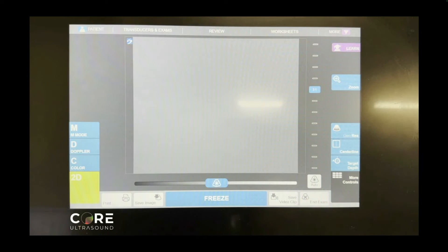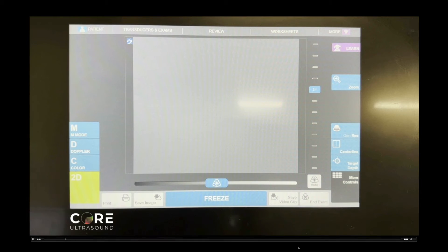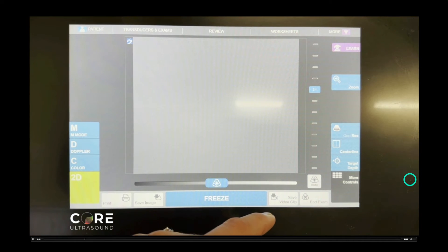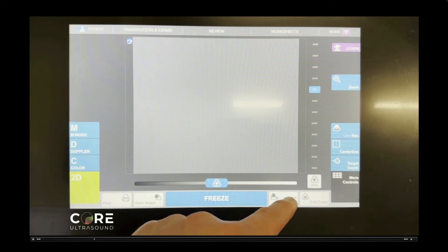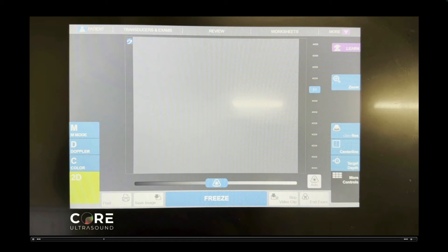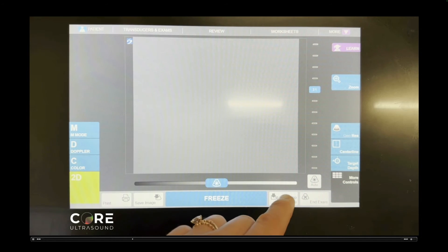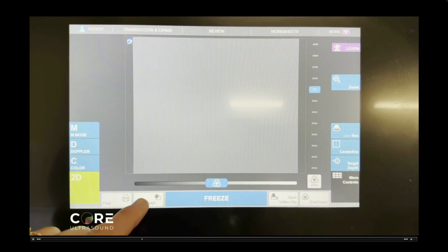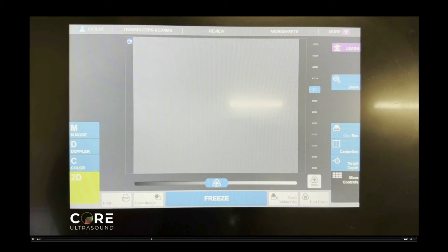Now to record images, you'll go ahead and hit that save video clip right here, or you'll hit the save image if you wanted to take some kind of a calculation there on the left side.